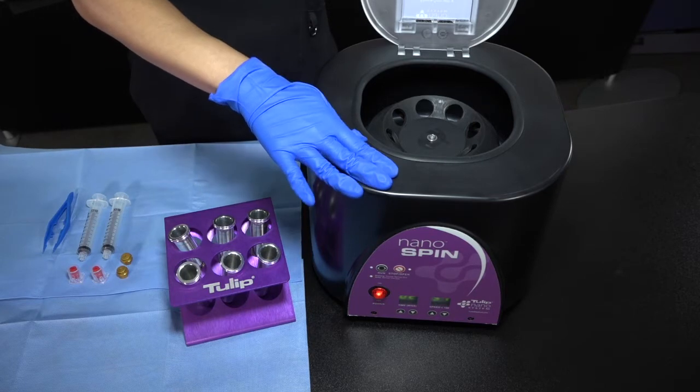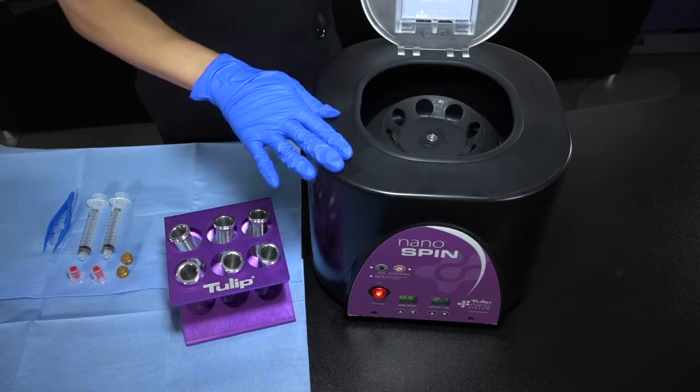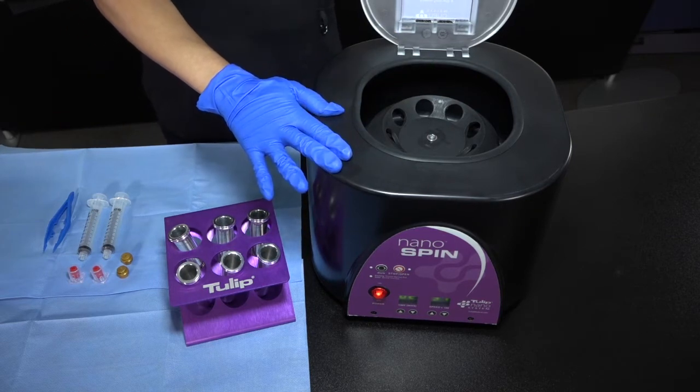All of this is considered unsterile. You have eight slots, so it can hold up to 80cc's of your graft.